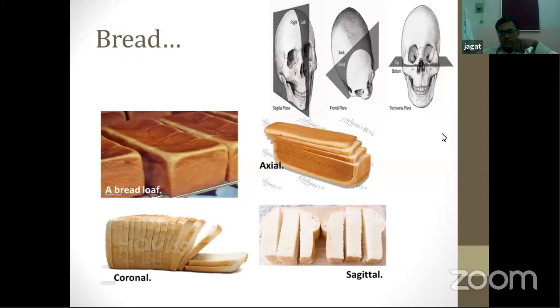Now, before I jump into the next slide, let's understand one small trick of the trade. When we do a normal radiograph, that is two-dimensional. So I get either the lateral view or the frontal anteroposterior view. These are the only two dimensions possible on a regular radiograph. The axial view is something we do not achieve on a conventional radiograph, other than on an occlusal radiograph, which gives us just one section of axial. That is why on two-dimensional images we can never appreciate the entire volume, or comment on the entire size of a lesion that we are looking into.